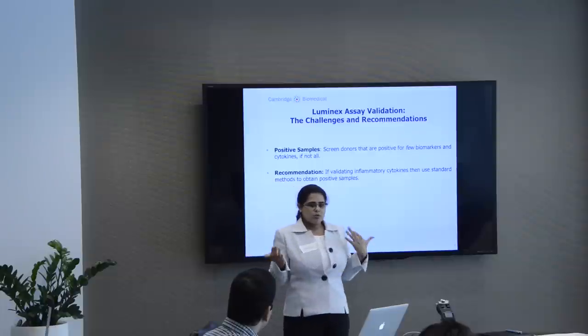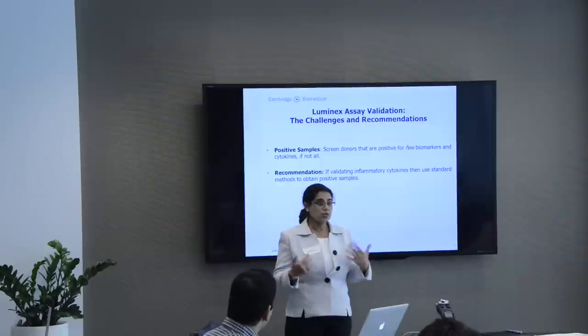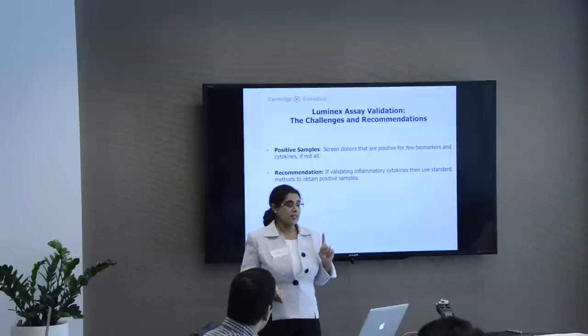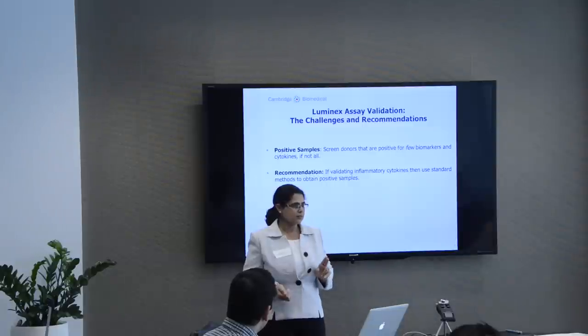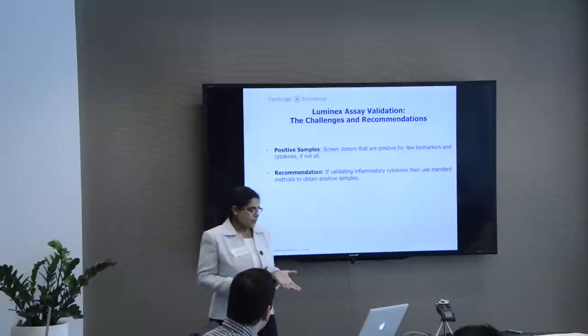What are you supposed to do? Are you going to screen hundreds of people before you get those positive samples? Because you need that one sample. It's multiplexing. You need that one sample to be positive for all those 15 cytokines that you're going to validate. So how do you get there?